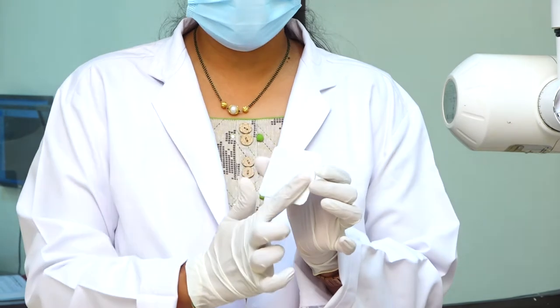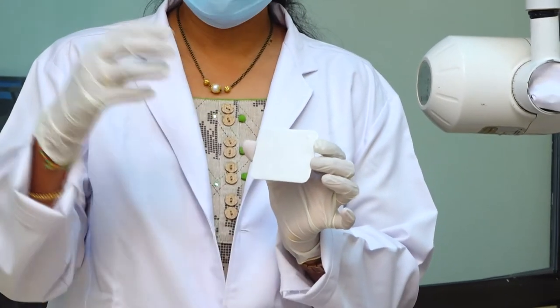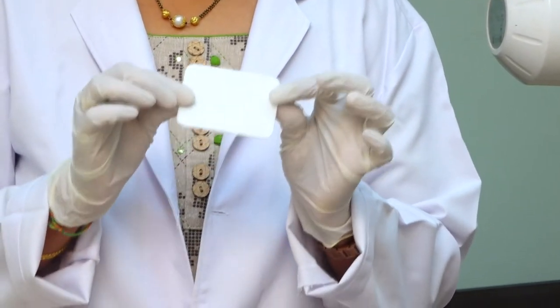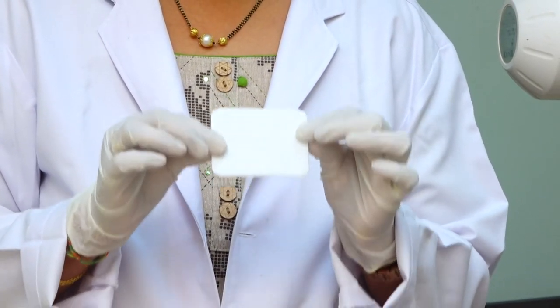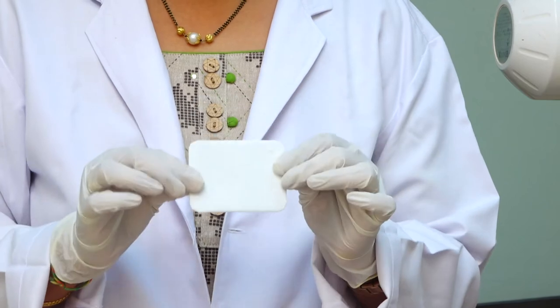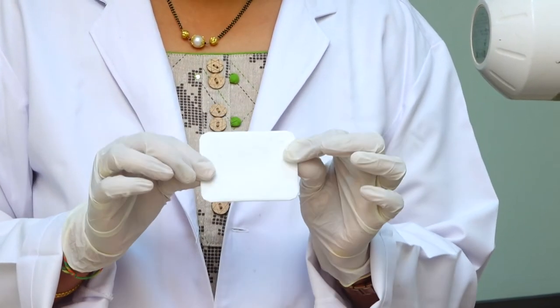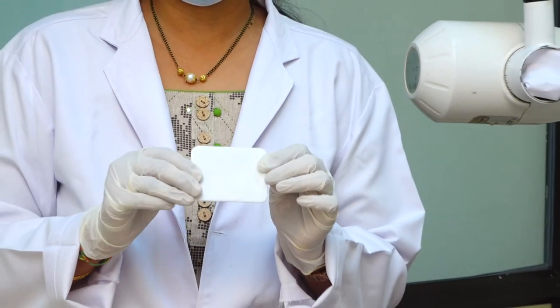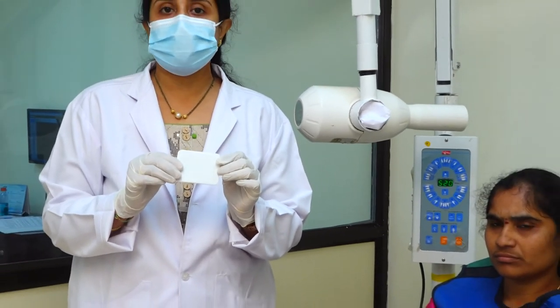This white surface, or the raised embossed dot, should be towards your tube head. In this film, we will cover the entire maxillary or mandibular arch depending upon the patient condition or situation. For the maxillary occlusal radiograph, it is of three types: maxillary anterior, maxillary cross-sectional, and maxillary lateral.